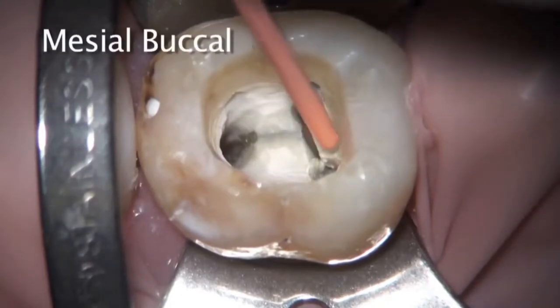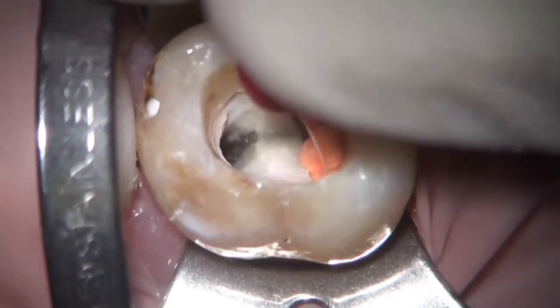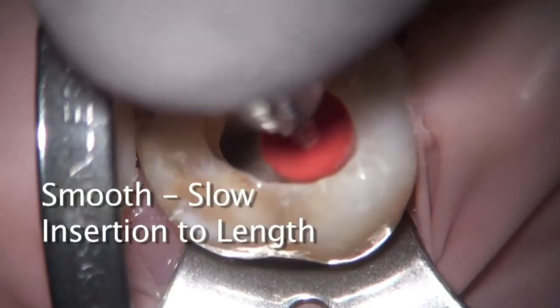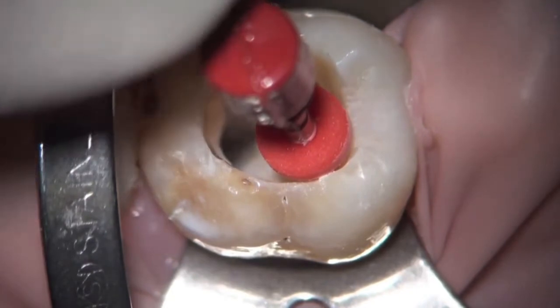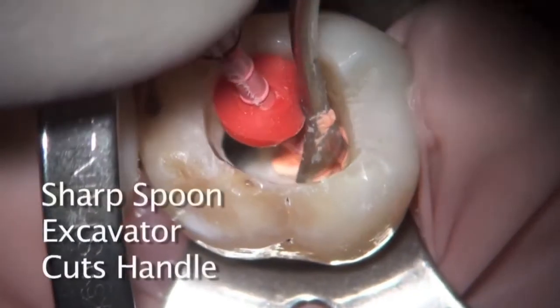As the carrier is placed, the important thing to notice is how slow it goes in — it doesn't need to be rapid and aggressive. When you think you're going too slow, you're going just right to the apex. Clinically, I would also place a paper point in the mesial lingual canal to prevent any gutta-percha from going over and clogging that orifice.